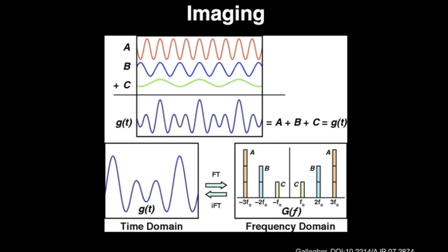And then the amplitudes of the ABCs in the lower right graph tell us how much of each of the frequencies was in that signal we're detecting. So what we're seeing here is that in A, it's unfortunate that they also scale it with the frequency, but the amplitude, the top to bottom of the A waveform, is larger than the B waveform, which is larger than the C waveform.